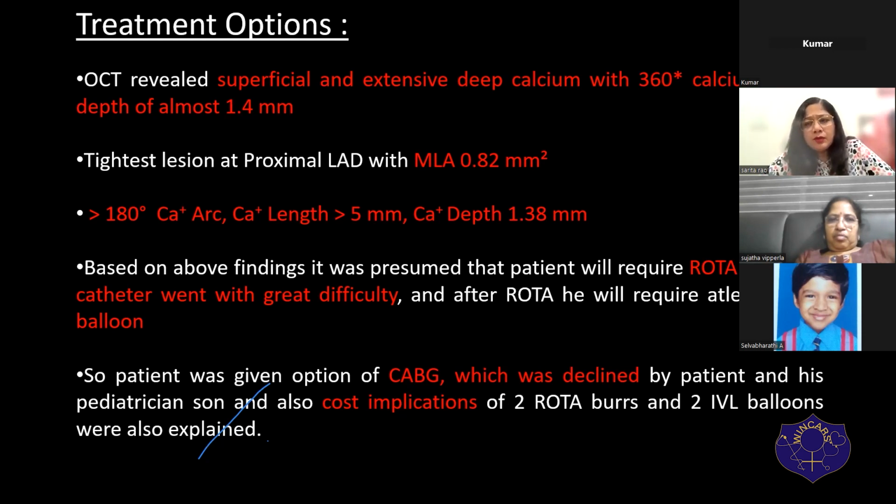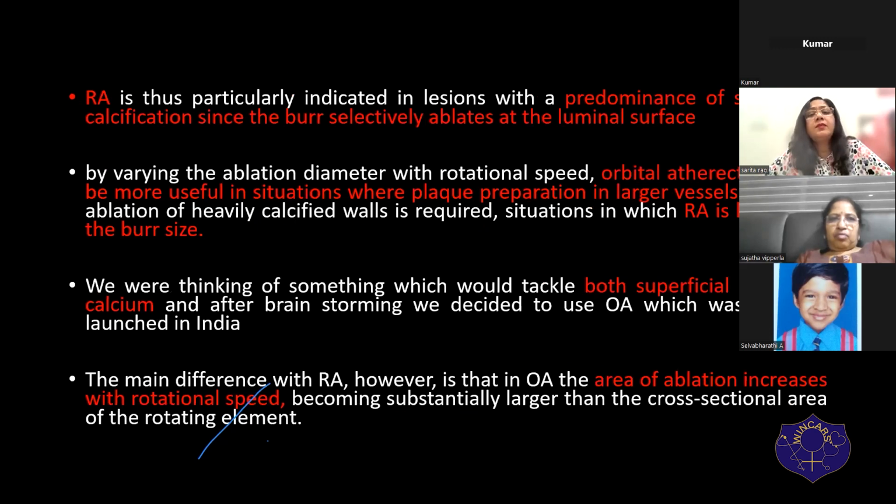So literally no slow flow, one burr solving all the problems, cost of procedure drastically reduced. So we decided, let's call for orbital. So we called for the orbital and let's see.